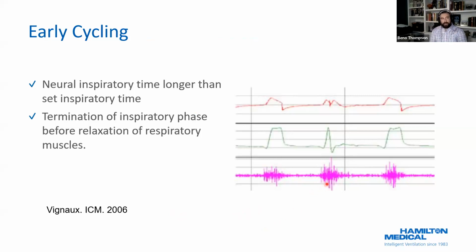So if you look at their diaphragm electrical activity, you'll see that the ventilator is cycling into exhalation while the patient is kind of at the back end of their effort, but they're definitely still making effort.